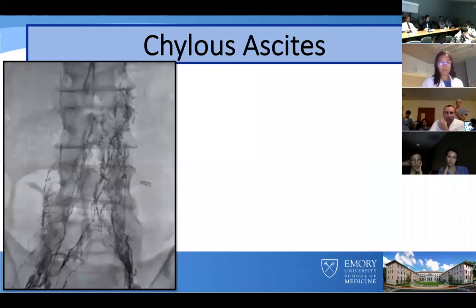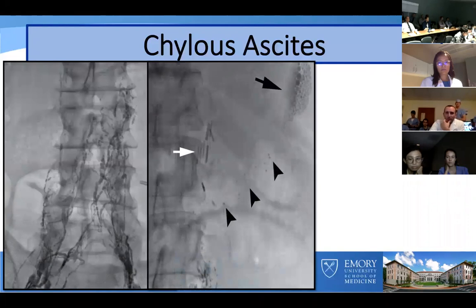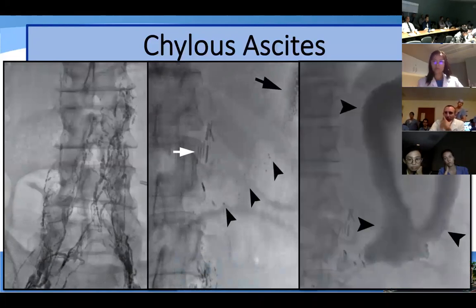So this was a 42-year-old male who had an incidentally found 7-centimeter RCC, had a left radical nephrectomy. For 6 months, he had a chyle leak before he was referred to our center. And you're going to see actually a fairly robust leak here just below the area of the clips. And just to show you how robust it was, all of the Lipiodol leaked all around his spleen over a course of about an hour during the procedure.